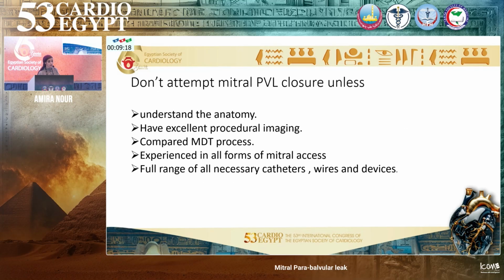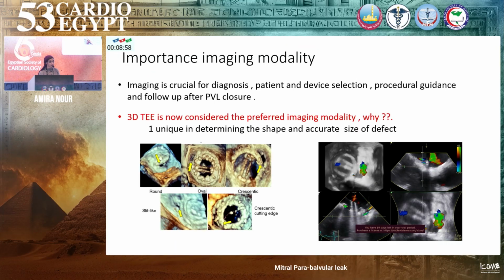But be sure that you do not attempt mitral paravalvular leakage closure unless you completely understand the anatomy of the valve, you have an excellent procedural imaging team after multidisciplinary team discussion, and you are in a center experienced in all forms of mitral access. You have a full range of catheters, wires, and devices.